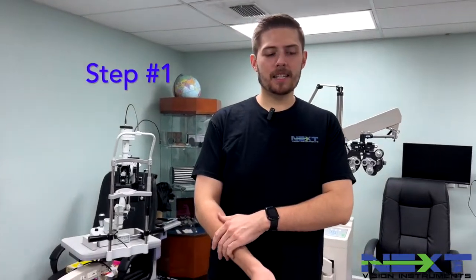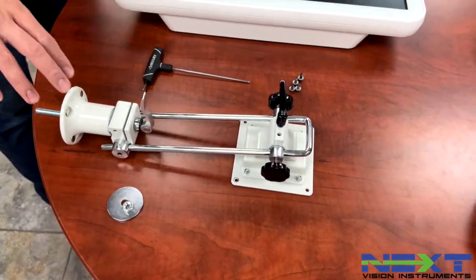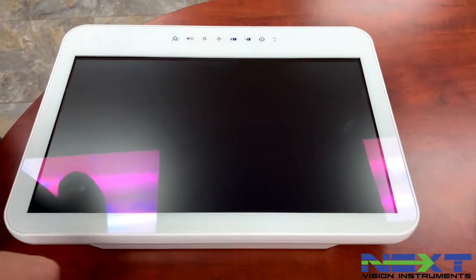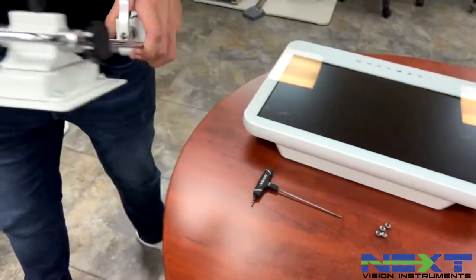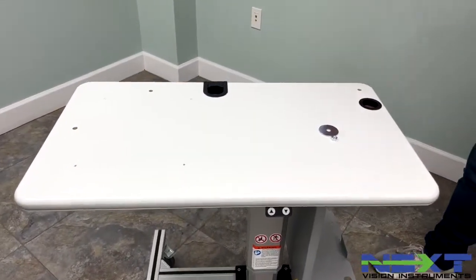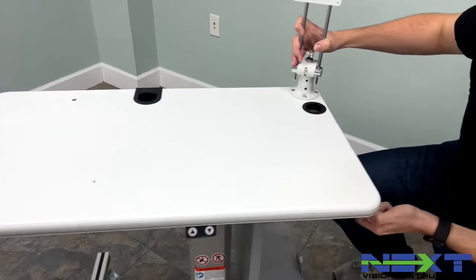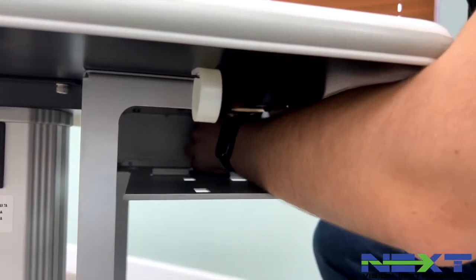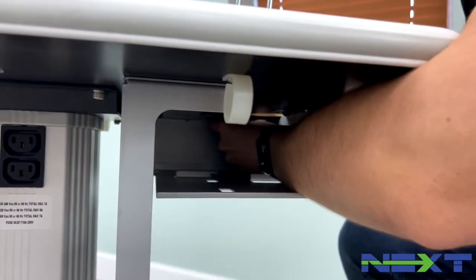We're going to start with installing the bracket and the all-in-one PC. You're going to need to locate the bracket with the nut and bolt underneath it, as well as your all-in-one PC with four three-millimeter screws and your three millimeter driver. First, take the bracket and bring it over to the table — it always mounts in the back right side. Drop it down in the hole, come underneath, place the plate under, and then take that nut and drive it up there.